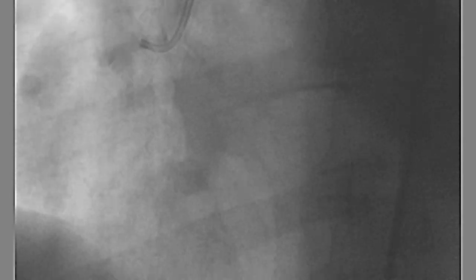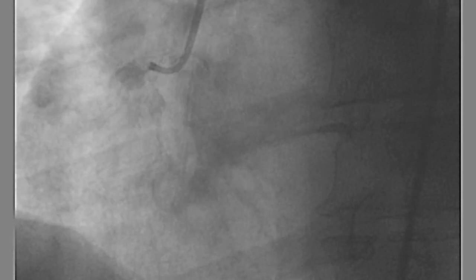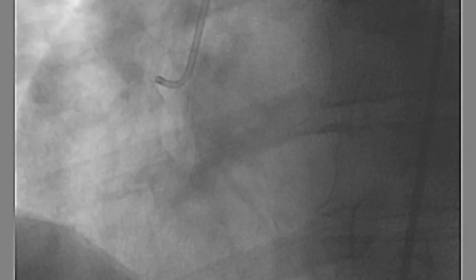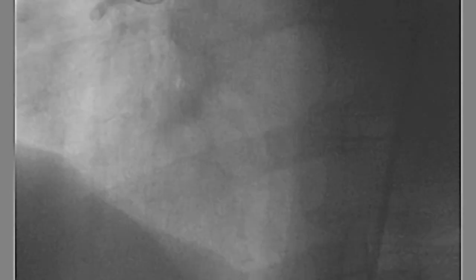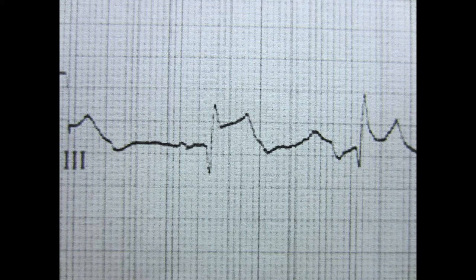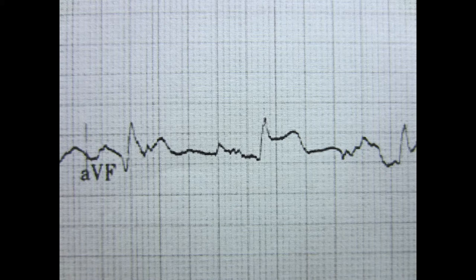In ST elevation, the pathology is a little bit different. There's 100% obstruction, so the whole thick piece of myocardium is not getting any blood flow. This is the cardiac catheterization of an ST elevation MI showing 100% total occlusion of the right coronary artery. The EKG shows ST elevations in lead 2, ST elevations in lead 3, and ST elevations in AVF.